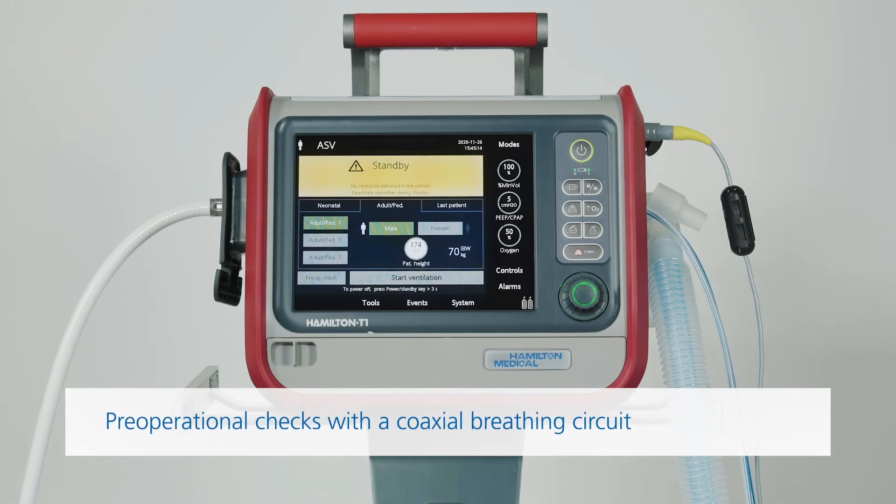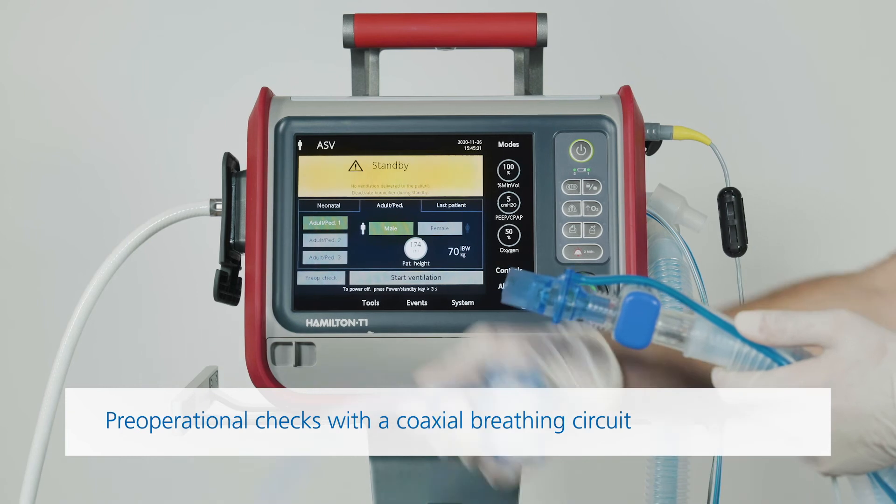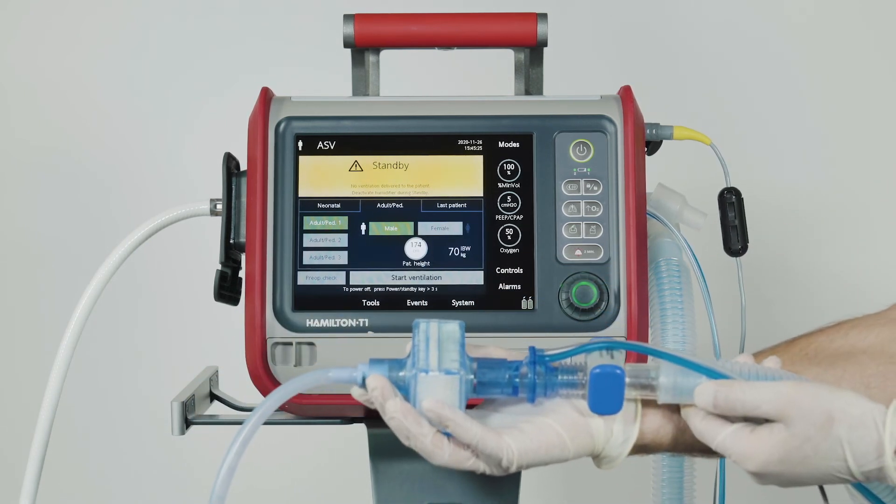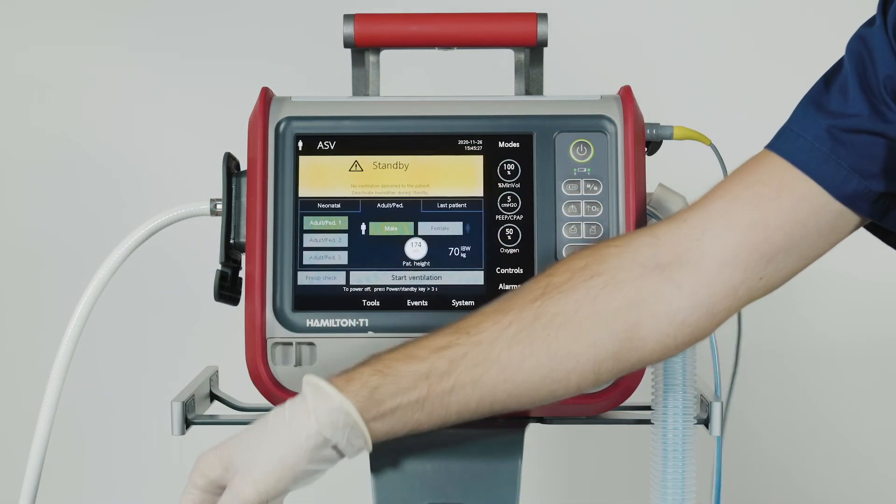If you're using a coaxial breathing circuit, do these pre-operational checks before you connect an HME filter. Once you've done the test and calibration, you can place the HME filter between the patient and the flow sensor.